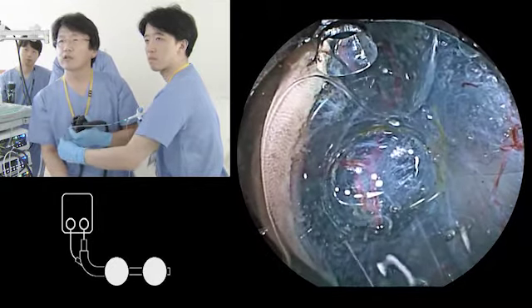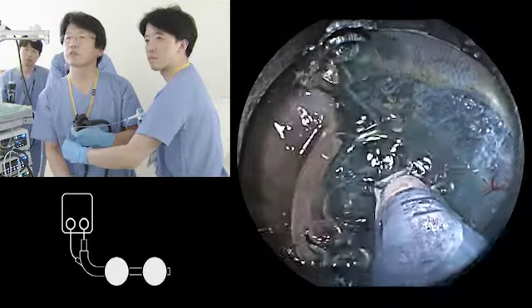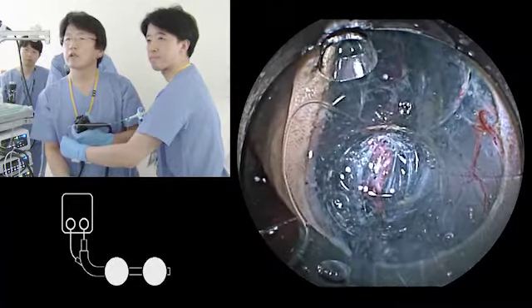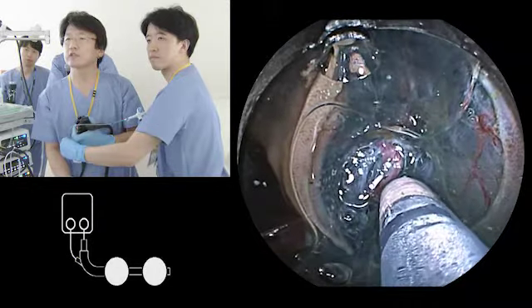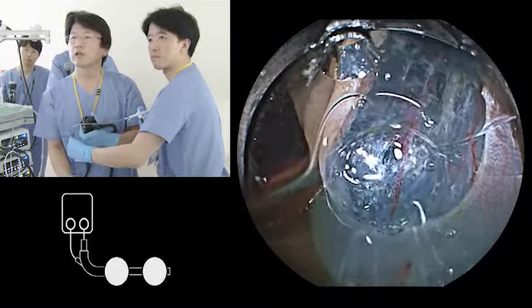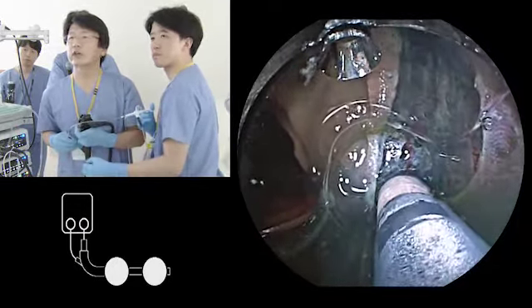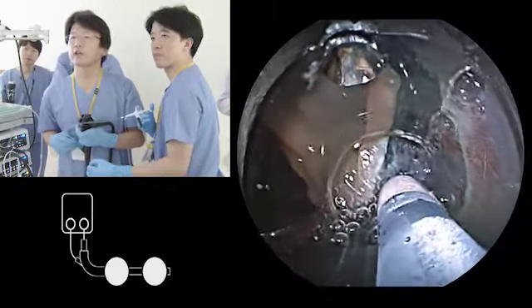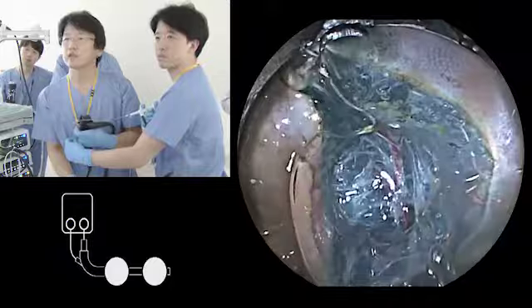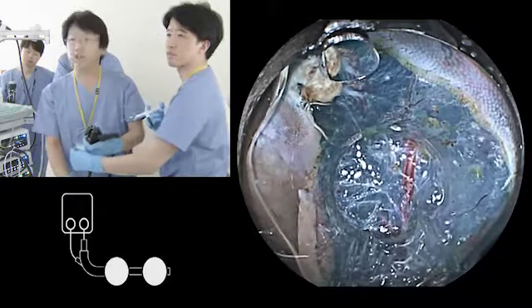Now I can come back and, okay, slowly come close to the muscle layer. But there is a blood vessel, okay? When you find the blood vessel, you just try not to touch. Don't coagulate the vessel, just dissect apart from the vessel. Right. I try to leave the vessel. I don't attack the vessel. So that is much more convenient, efficient, I think. Just leave the blood vessel, and then you can coagulate the blood vessel later.